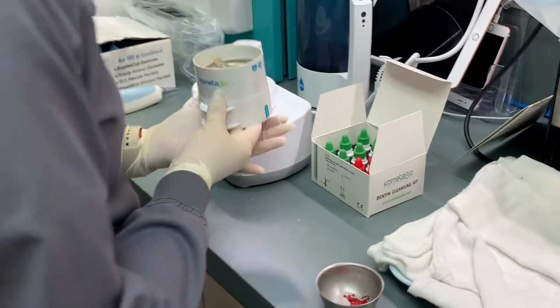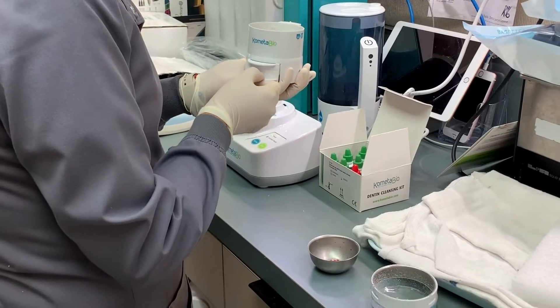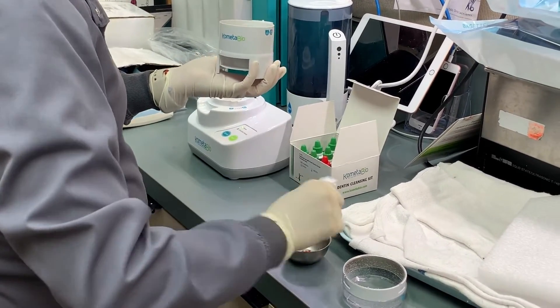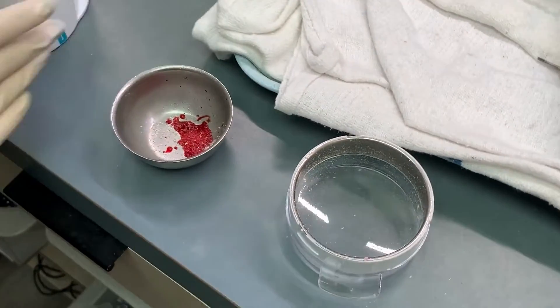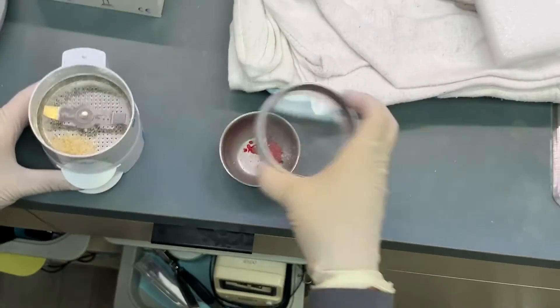So now we have the bone. Those are just a little... you know what, we can grind a little more.